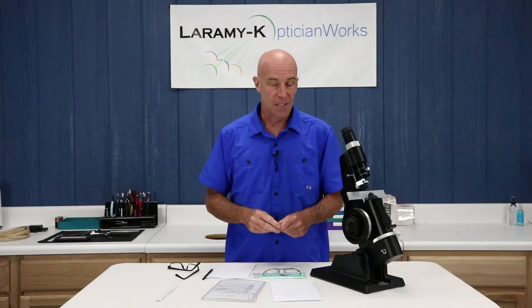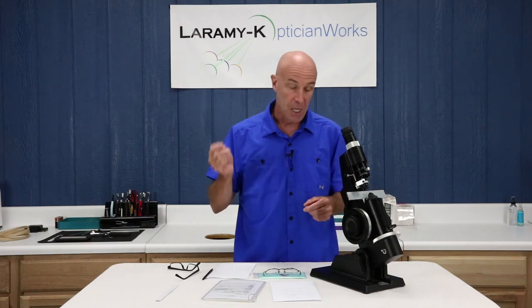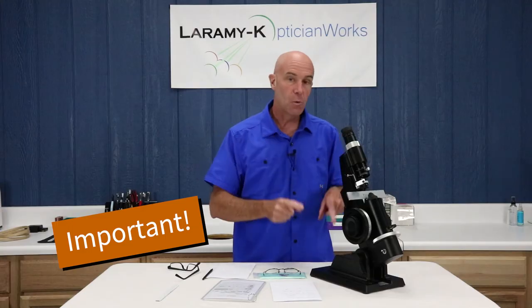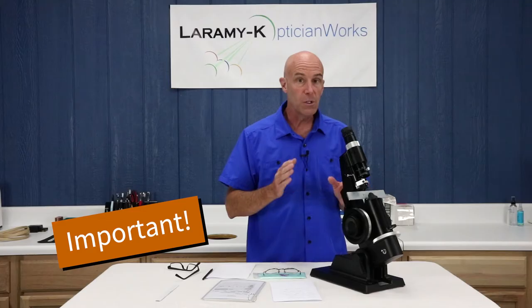Last but not least, I know you don't readjust the lens meter for individual use every time you go near the thing. When you're handed a pair of glasses for neutralization, make sure you take that step. Take that minute, refocus it to zero for you before you go trying to read that prescription.